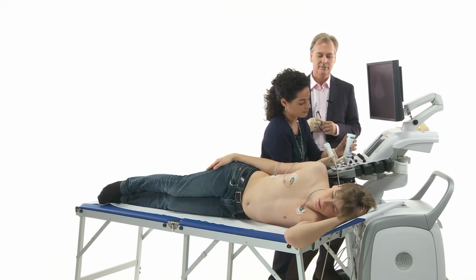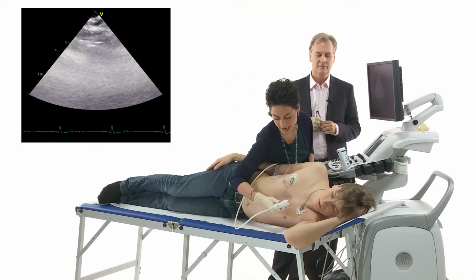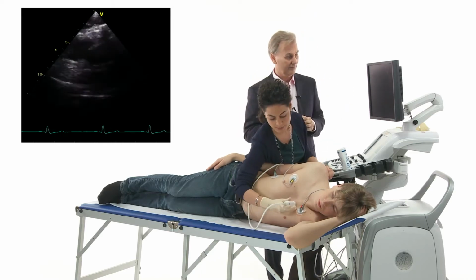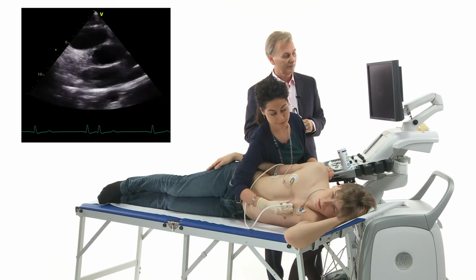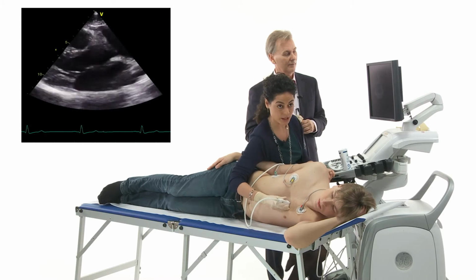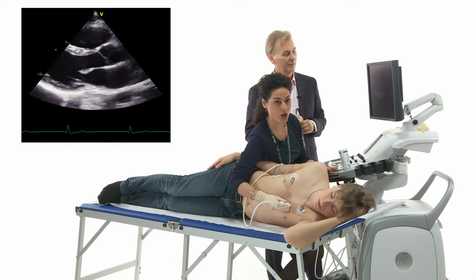Our patient, you can see, already has his left arm under his head. It's important to always get good images. We put the transducer again on the left part of his chest. We are using the parasternal approach. You already learned about it in the previous section, but now we are using the long axis view.